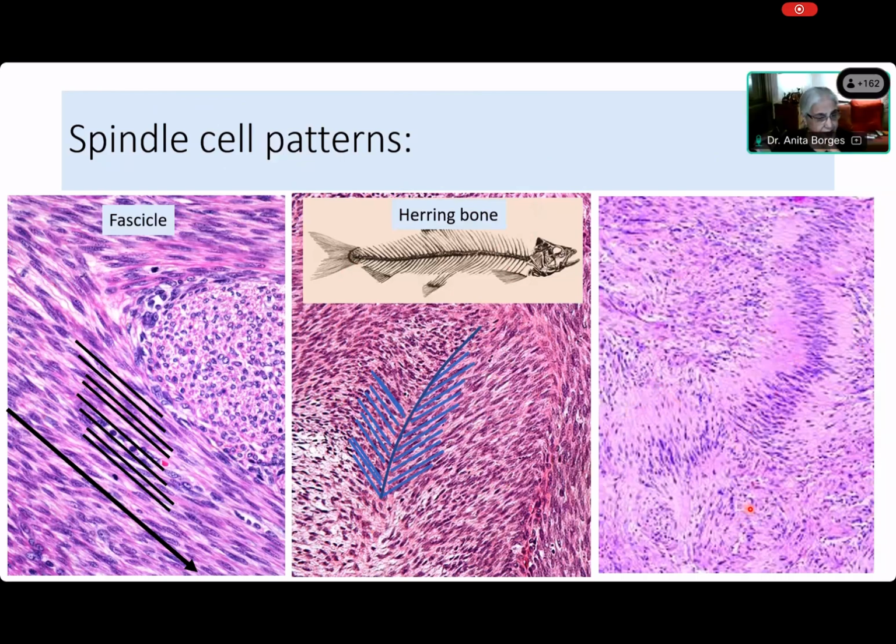All right, so you're having difficulty, Priyamata. All right, let's ask Elsa. So, do you agree it's a fascicle? Palisading pattern. It's a palisade. Okay, so why is it a palisade? She said something about being parallel. Yes, they are parallel. You can see, right? Ma'am, the nuclei are parallel to one another. But why is it then not a fascicle? And the nuclei are perpendicular to its axis. Perpendicular to the axis. Exactly.